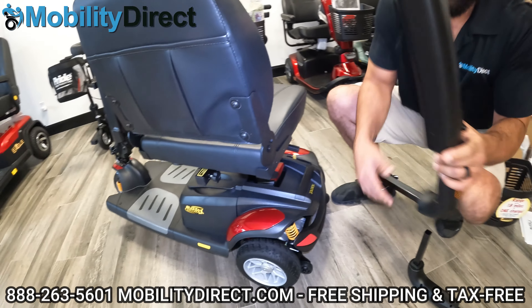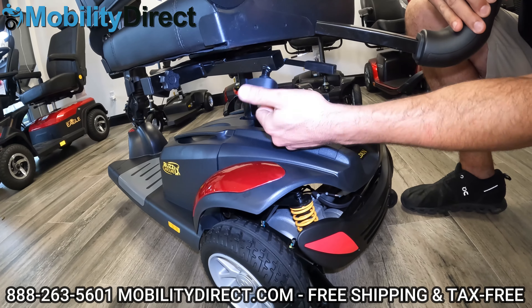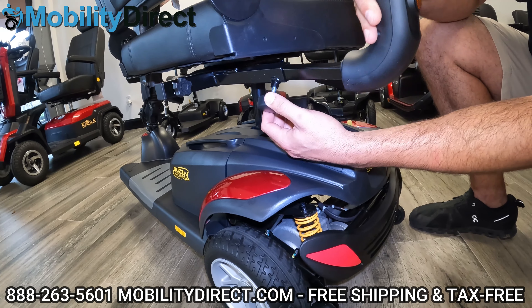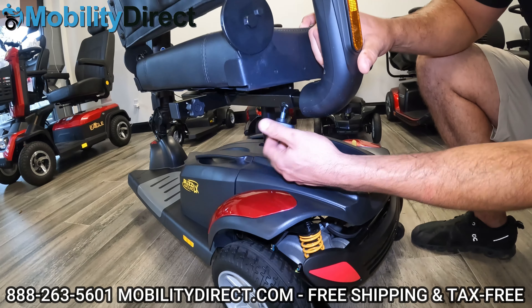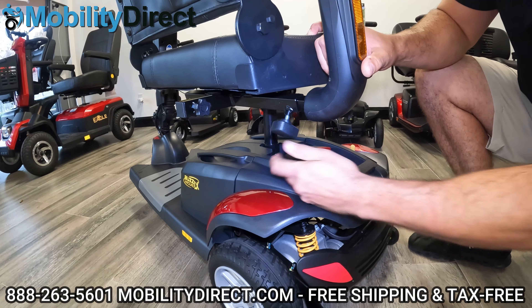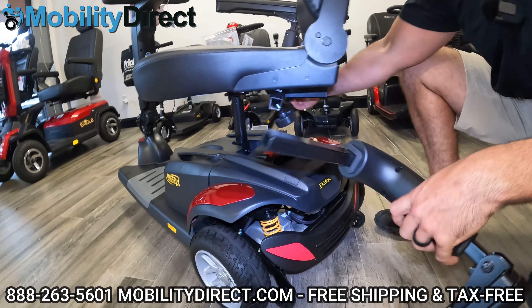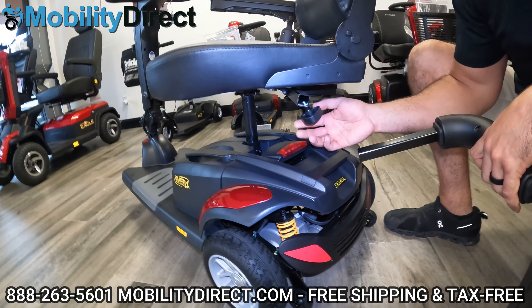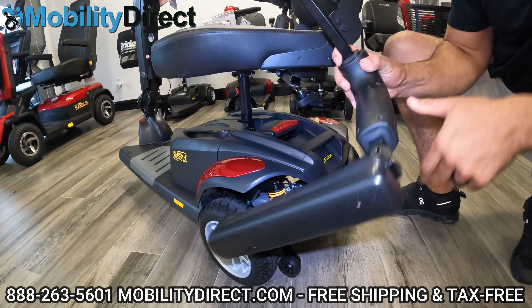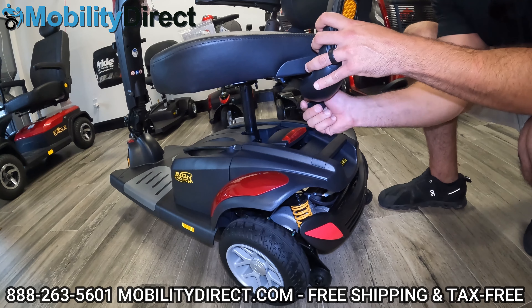As far as the armrests go, they are flip-up armrests. The seat does rotate — here's the lever — you can go 360 degrees and it locks into position. This is the left armrest. You need to put it into the sleeve, but loosen the knob all the way so it can slide in, almost to the point where it's about to fall out. Then put it where you want it — you can adjust the position for more space if needed. Then just put it in the sleeve and tighten up.